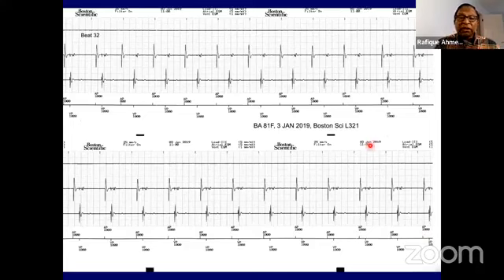Now, this feature, as I told you, should be programmed in places where you want to minimize ventricular pacing and you believe there is AV conduction. Otherwise, you don't want to program this feature. Any feature in a pacemaker wastes battery. Even if you save 1 month of battery, it's important. So features that are not necessary should be turned off in pacemaker programming and make the pacemaker simpler.